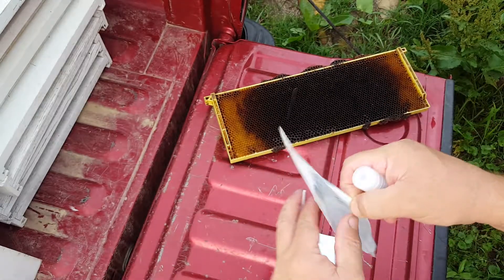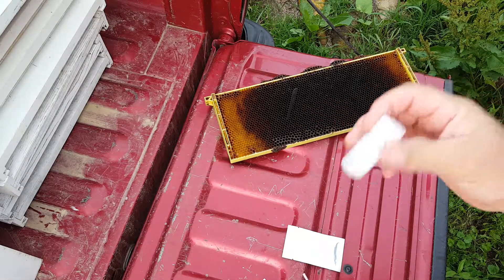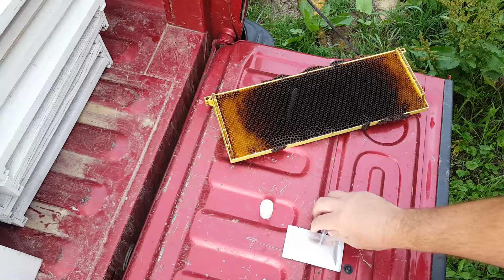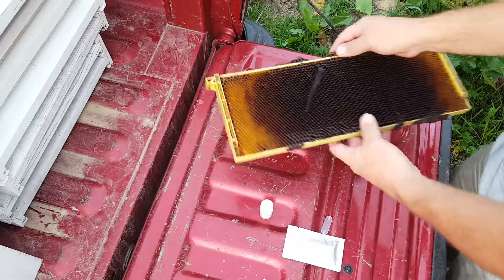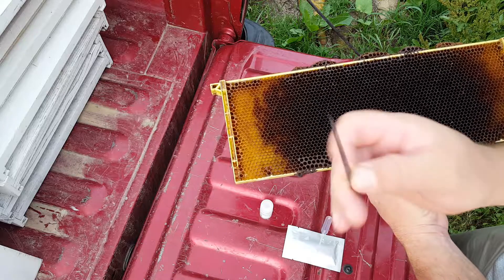This is the actual test. You get your dauber, your empty bag, and your solution. Just shake it up. We're gonna set that right there, put our dauber right here. Make sure the tip is not going to pick up any other information on there. That tab — some are white, some are black.